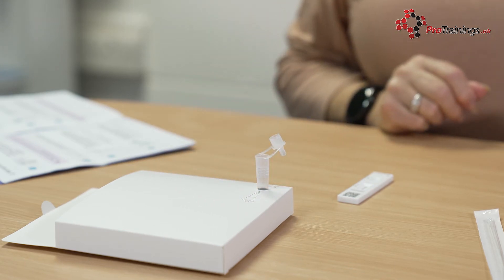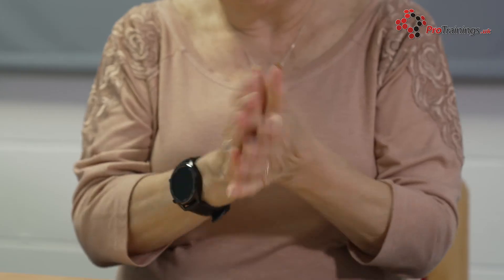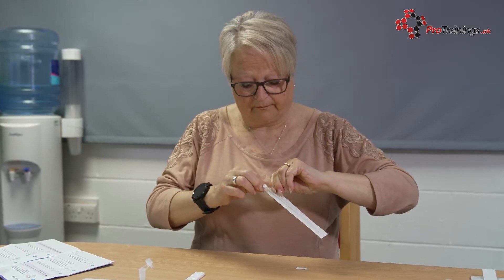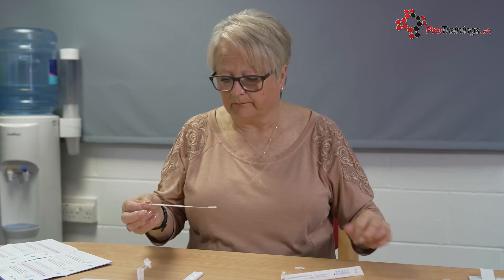Gently blow your nose into a tissue and then throw the tissue away into a bin. Wash your hands again for at least 20 seconds or use hand sanitiser again. Pick up the swab and open it when you are about to take the test, and take it out of the packaging.